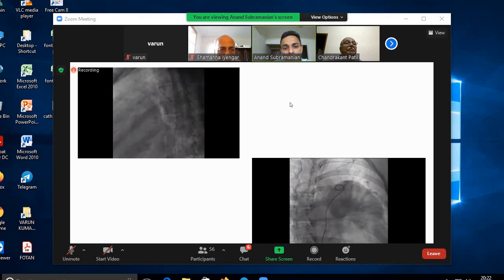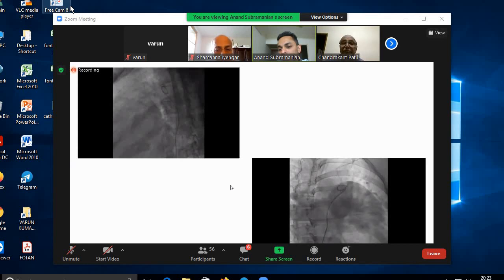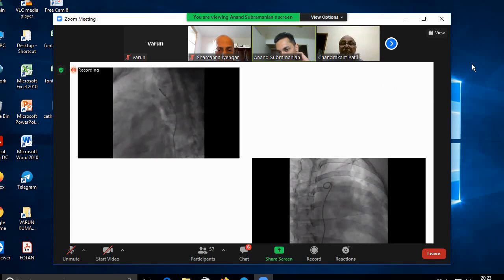Now, the quality of this angiogram is not bad. In fact, we've given sufficient contrast, almost 30 ml. But this is something which we encounter if you do adult PDAs with such large shunts, because there is a lot of blood flowing into the PA and the contrast gets diluted. And the catheter you can see actually flipping into the PDA when the power injection starts. That's because of such a large duct. But the duct is, I think, very well appreciated on the RAO view over here. So again, entering into the PDA there.